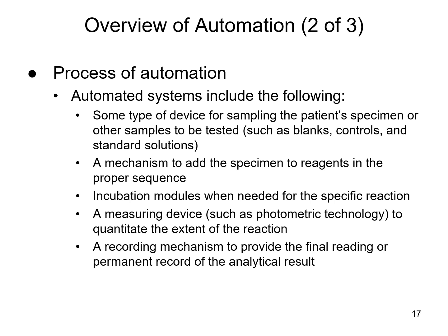And then it's going to also be able to measure that sample volume and add that to reagents. So there's usually some sort of reaction wheels. Depending on what the test is, it may have to put the sample with a particular reagent, and then it incubates in that analyzer, and then that moves to another reagent. Maybe it's looking for a color complex. And so all of this is kind of built into the machine.